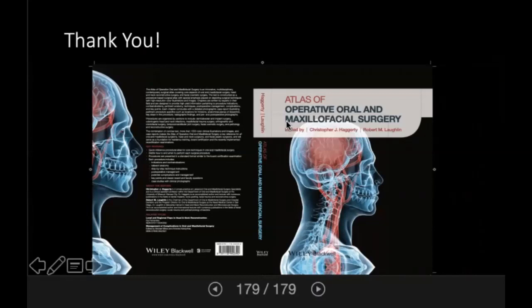Again, those implants need to be placed very parallel. They need to be placed in bone that has the appropriate density or Hounsfield units to support the masticatory loads on the locators. And of course, the maxillary denture has to be made so that it can place pressure on the implants or on the locators and also have sufficient pressure on the palate to share some of that load. So I think locators are indicated in the maxilla, but you definitely have to be more careful when you're planning them than when you do in the denser mandibular bone.